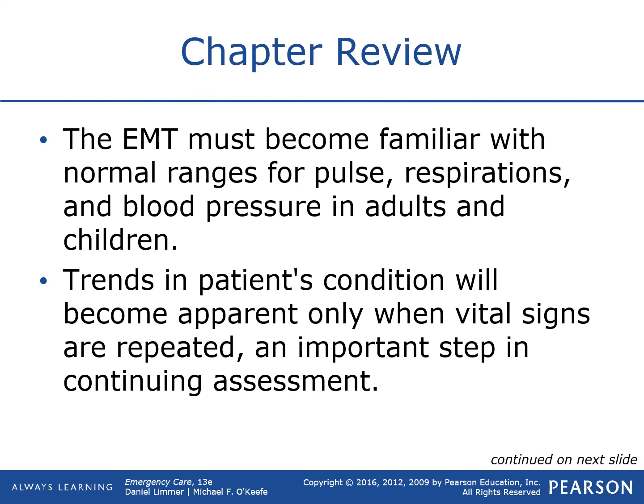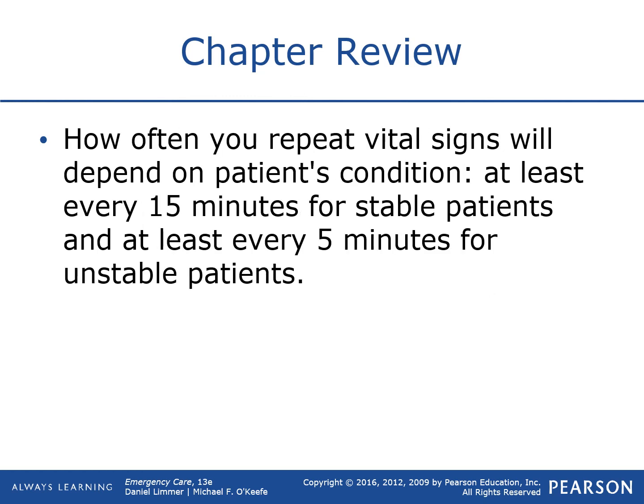Trends in patients' conditions will become apparent only when vital signs are repeated. That is an important step in continuing assessment. That's why we take a baseline set of vital signs and then we repeat the vital signs. Again, the frequency we repeat them at depends on the patient's condition. How often you repeat vital signs will depend on the patient's condition: at least every 15 minutes for stable patients, and at least every 5 minutes for unstable patients.